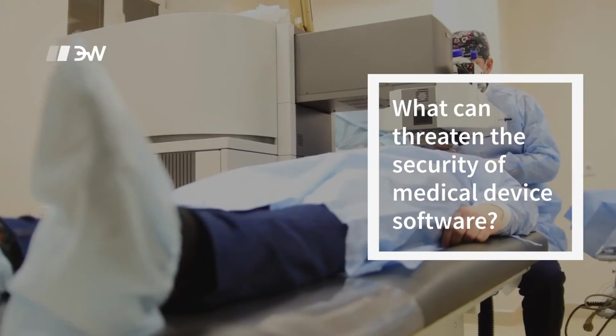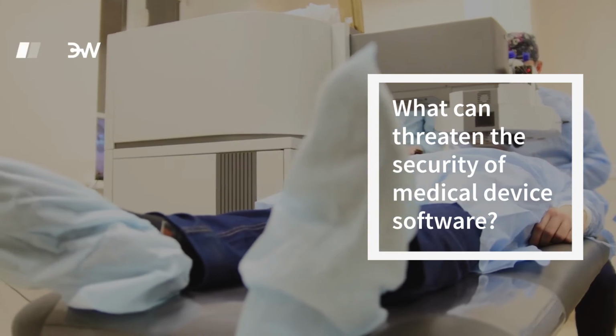What can threaten the security of medical device software? Obviously there's the threat of immediate physical harm in many medical device situations. A somewhat tangential concern is hospital ransomware. IT in hospitals is not a medical device, but the security of those systems is also very important for medical outcomes, because there have been many examples of ransomware taking over hospital systems and preventing doctors and nurses from doing their work.